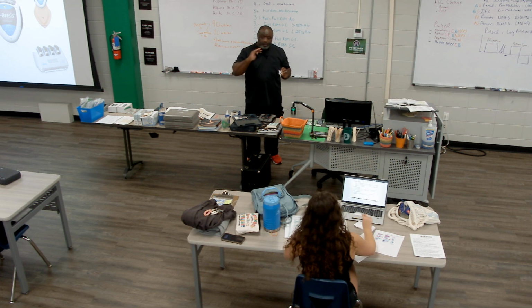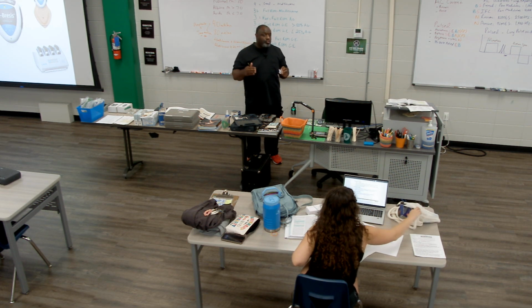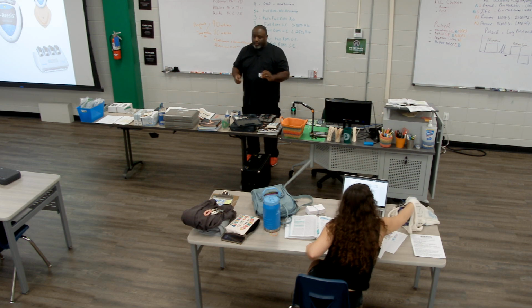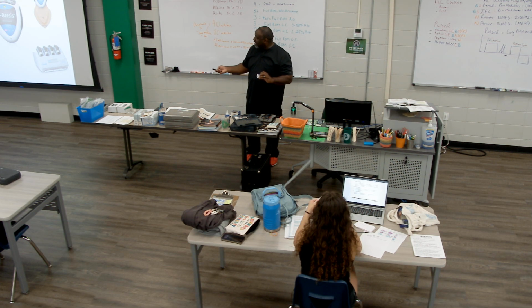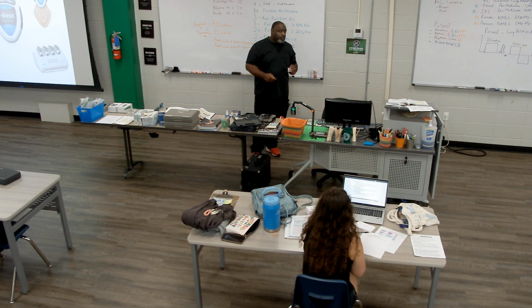Like if I want them to stay for the full 20 minutes, I put it on 2 and have it run for 20 minutes for a 40 milliamp dosage. So that's called standard treat. So I just hit the button called standard mode, and it goes right to standard. It'll go to standard mode, and I can select either 2, 3, or 4 milliamps of current.